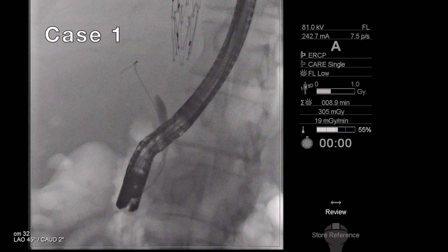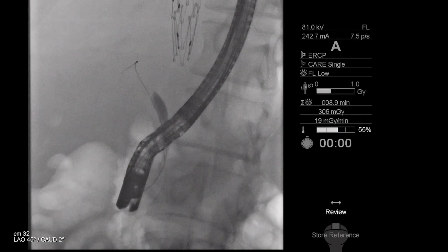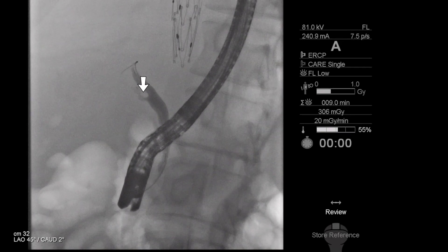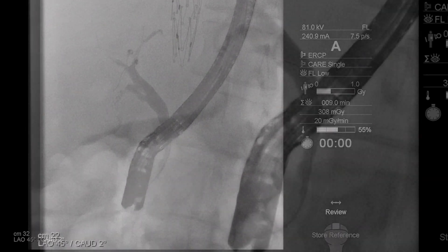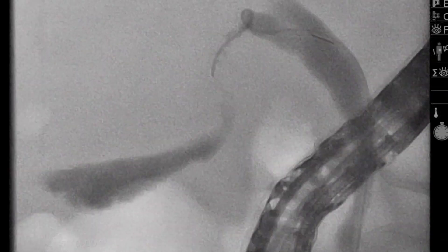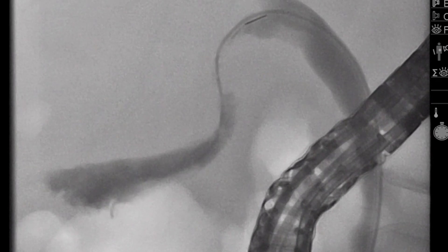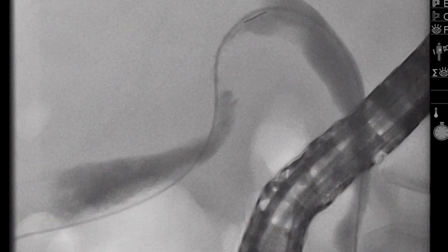Understanding each individual patient's anatomy is the first step. Here we can see the cystic duct easily identified on cholangiogram. With the catheter advanced in bowing to improve angulation, the cystic duct is cannulated, in this case with a 0.035-inch guide wire. The use of an angled wire is essential to successful cannulation of the cystic duct and navigation across the spiral valves of Heister and into the gallbladder.